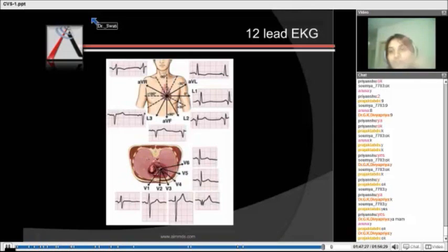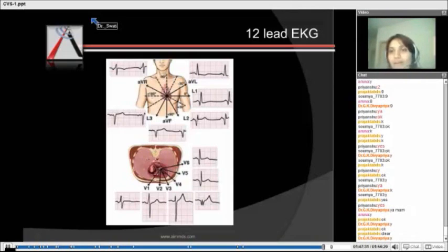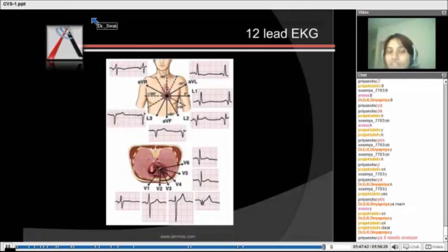And what we saw, the first basic ECG, is usually the one of lead 1, or the common general waves. That is the general thing which we consider. Usually in questions they do not mention a particular lead. Yes, it needs a revision. Definitely it needs a revision. But hopefully that makes things about the ECG a little bit clear.